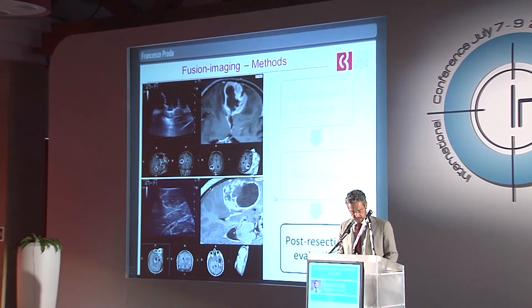When brain shift occurs due to the presence of the tumor or CSF leak, we can correct the navigation by performing a fine-tuning. This is an example of an in-plane correction in which the tumor bulges out, so we brought back the MRI, and also an out-of-plane correction when there is distortion due to movement of the organ. The fusion imaging ultrasound can be performed several times during surgery and is not at all time-consuming. This is a temporal glioblastoma in which we can see a residual; superimposing the two images we can compare the two modalities. After resection we have not only brain shift but also brain deformation.